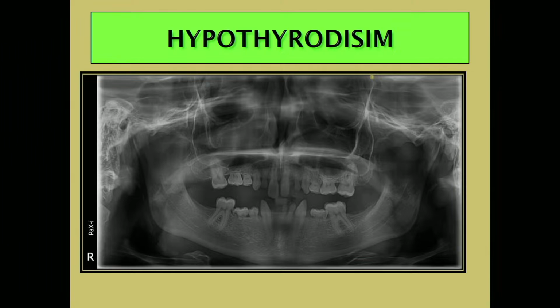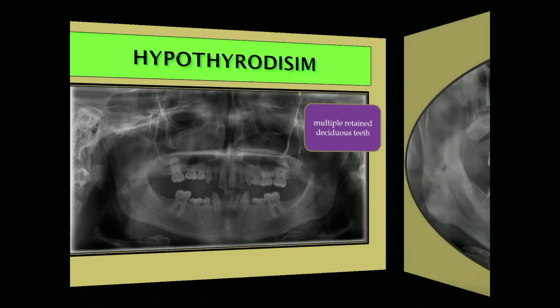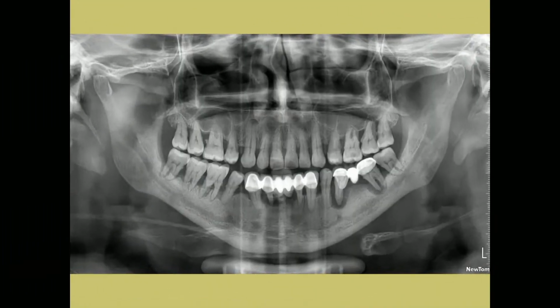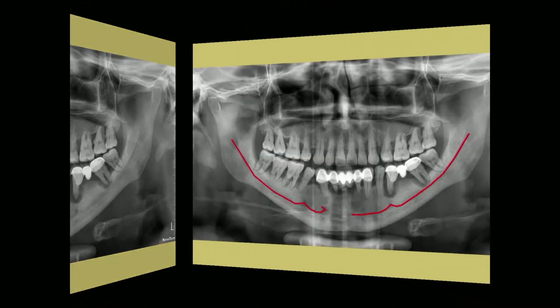Missing multiple teeth, hypothyroidism. Some cases, yes, definitely you can go for OPG or two-dimensional, where the inferior alveolar canal is distinctly seen with a cortical border, where the anterior looping is also seen, and this is fairly enough that you can rely on 2D. You see an anterior loop and the extension that comes anteriorly also. So you have to observe the OPG very carefully before you go for a 2D or a 3D modality.